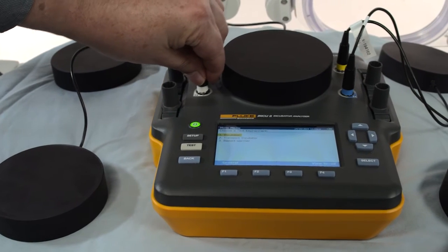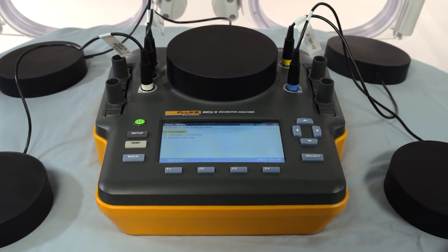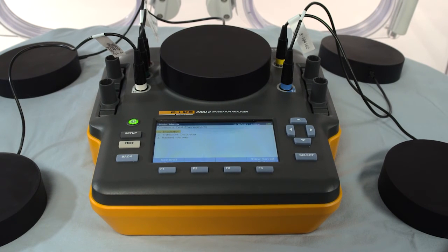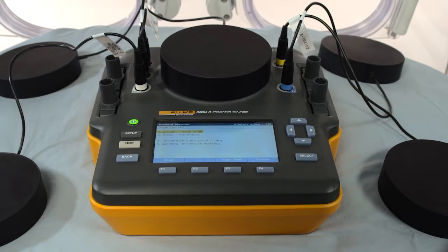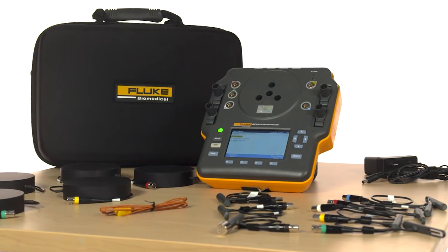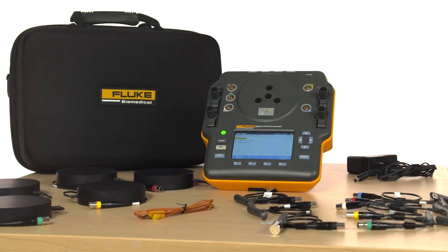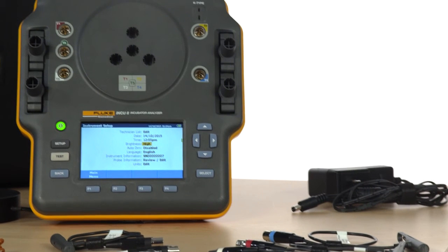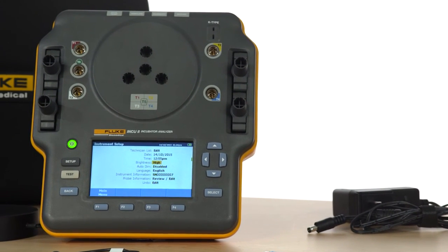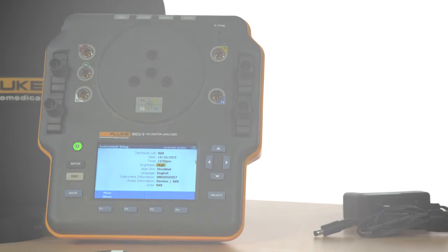To test radiant warmers, simply replace the temperature probes with the radiant pucks. Position them around the warmer according to the standard, then select the appropriate test and testing environment. We've designed the INCU II to not only be highly portable and easy to use, but give our customers a best-in-class, all-in-one solution. The INCU II is compliant with all global IEC standards for radiant warmers, incubators, and transport incubators. Learn more about the INCU II by visiting flukebiomedical.com.